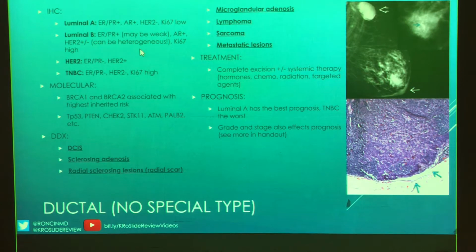So you could have areas that are definite HER2 3+, so positive, and then you can have other areas that are really wimpy, 1+, or even 2+, where you're considering running the dual ISH. Or you might be in an area that does both. You could be in an area that does FISH. So all these things are possible.